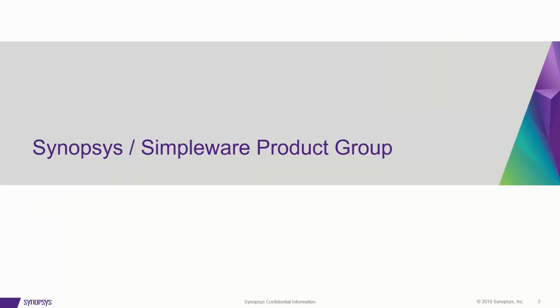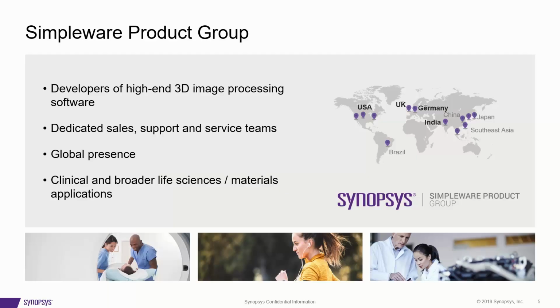So, as I said, an introduction to the Simpleware products group. We are really focused on developing high-end 3D image processing software, and this really accounts for 3D images from a variety of different sources, including CT and MRI in the life sciences arena. Our focus is entirely upon ensuring we can analyze the images from those different modalities as quickly as possible and produce what is needed to get to the next step of analysis or design as quickly and efficiently as possible, so time isn't spent on the image processing side or segmentation side when it's not necessarily needed.